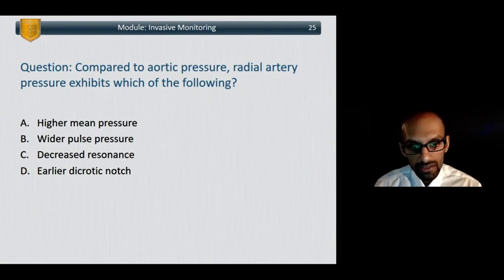You get increased resonance and a delayed dicrotic notch because of the delay in the travel of the wavefront away from the heart.